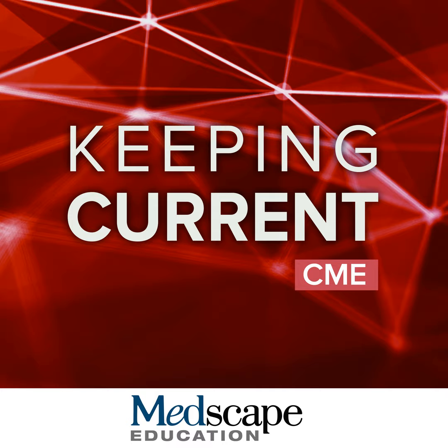What about patients who undergo transplant? Again, transplant is a curative option. What happens? And again, the recurrence-free survival is 4.5 times worse in patients with perilesional hepatobiliary phase hypoenhancement, even after transplant. So this is a very strong predictor of poorer outcomes when it's present. So again, this is in patients who do have HCC.